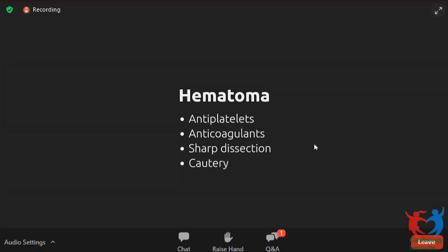But suppose it happened during the procedure, you didn't realize, and the next day or the day after you have a small effusion and you find that your lead is out, I would say it is better to try and withdraw the lead and place it endocardially, because this can keep on migrating and it can result in problems. So generally, I would prefer to put it back. If you pull the lead back in, the effusion doesn't increase too much. You can just stay ready for pericardiocentesis, and then you can place the lead in the new place.